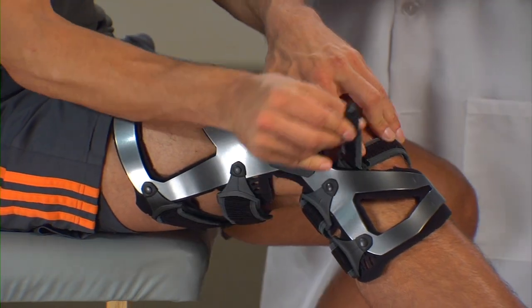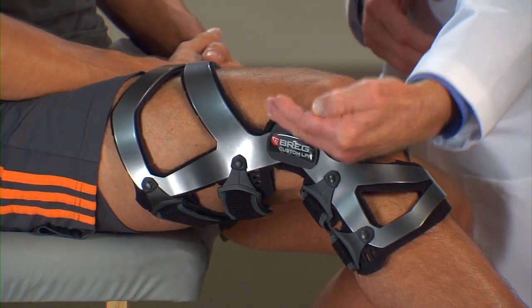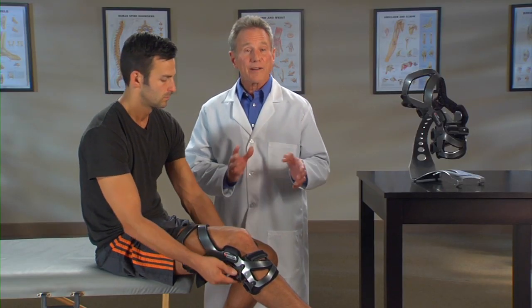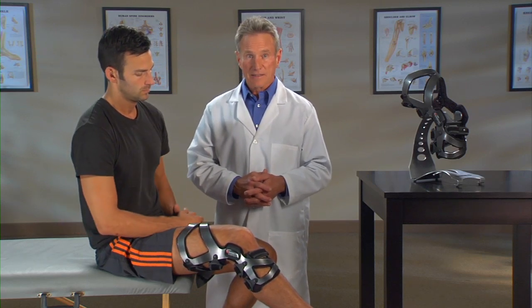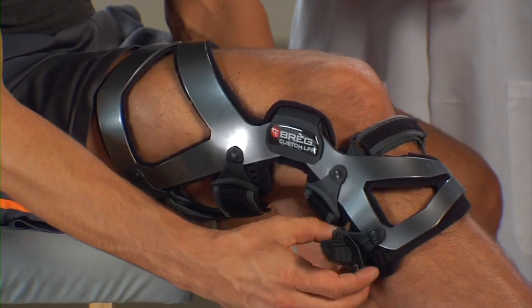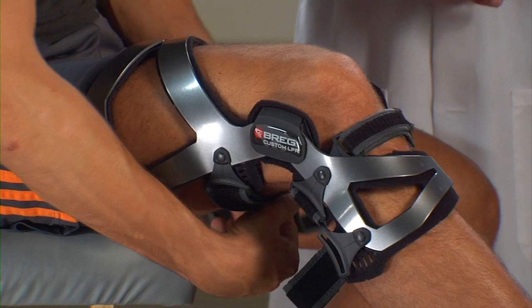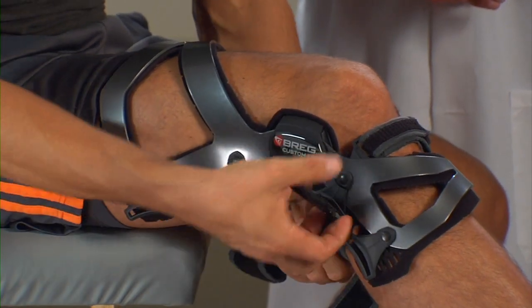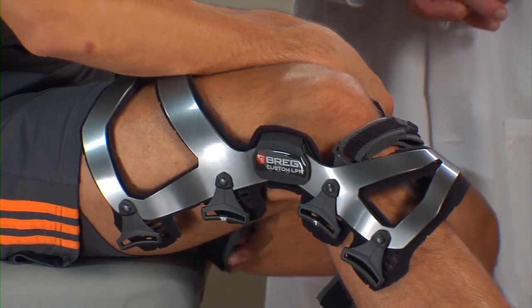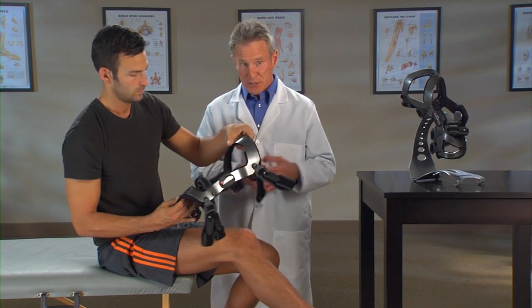While re-tightening the straps, be sure the brace hinges align with the top of your kneecap and that the hinges are at or slightly behind the midline of your knee. For PCL-specific applications, apply all of the back straps first and the front straps last. To remove the brace, unfasten all the straps but just loosen number three. Then remove the brace. Fold the hook loop tabs back against the straps for easy storage.